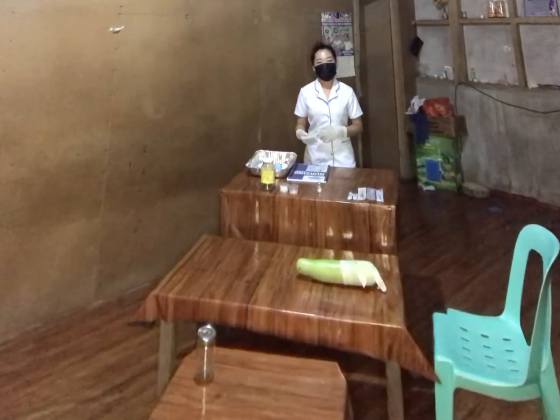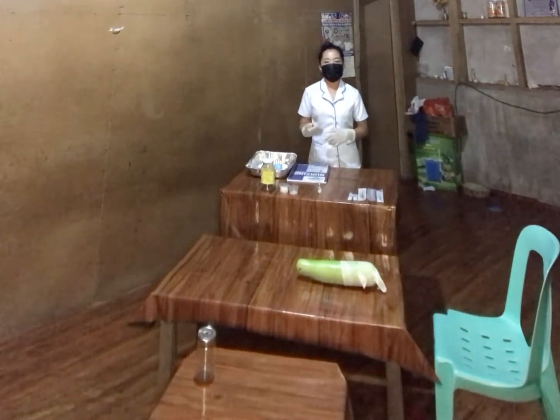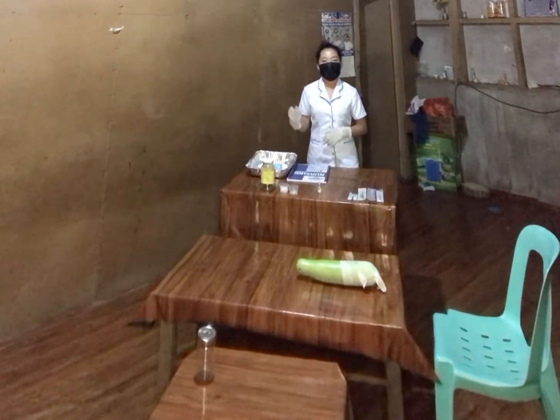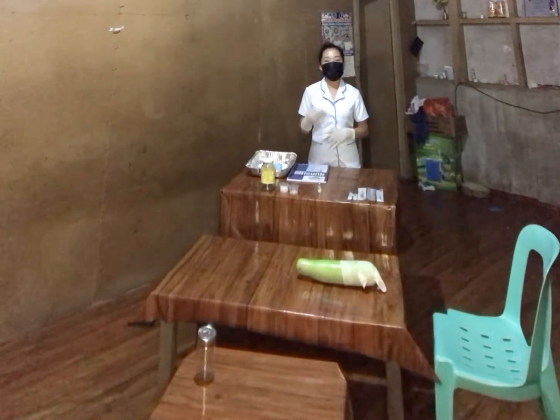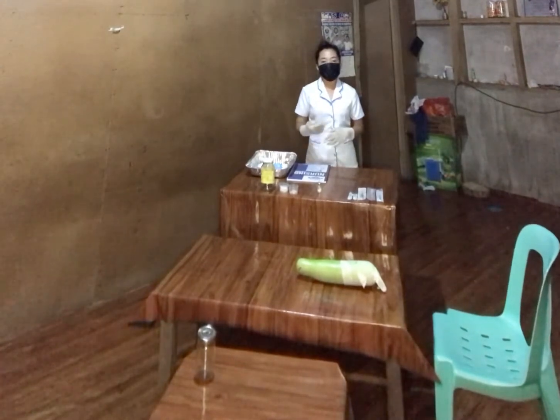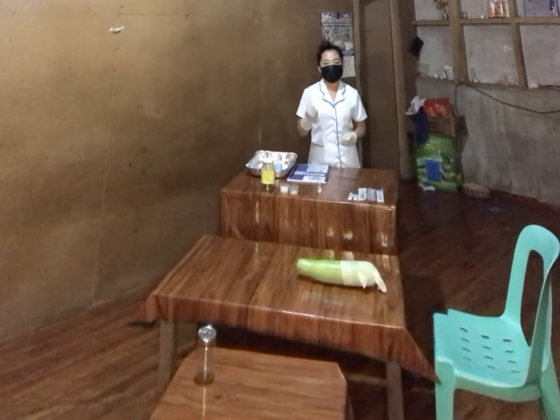So the first thing that we have to demonstrate is the intradermal, a shallow or superficial injection of a substance into the dermis, which is located between the epidermis and the hypodermis. I am already done performing hand hygiene, and now privacy for the patient.